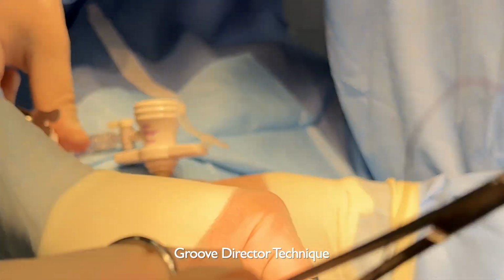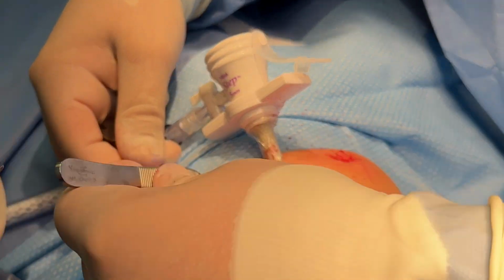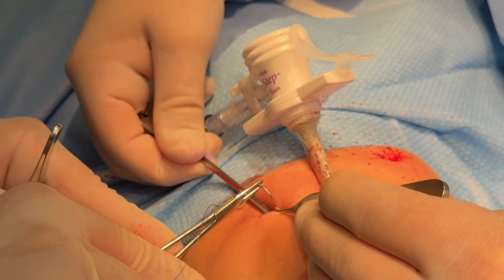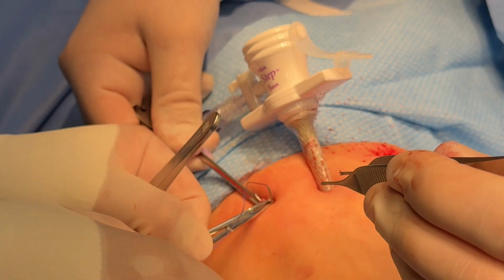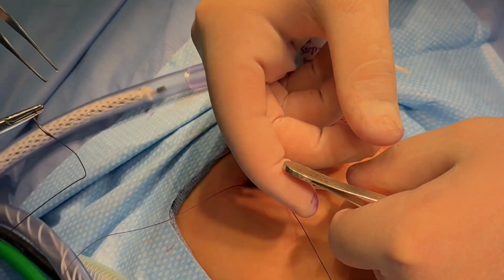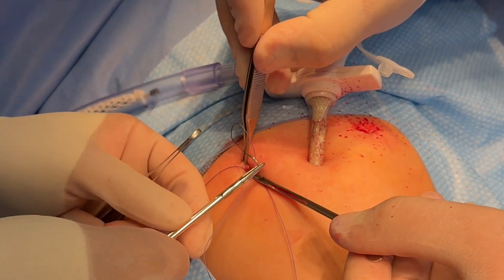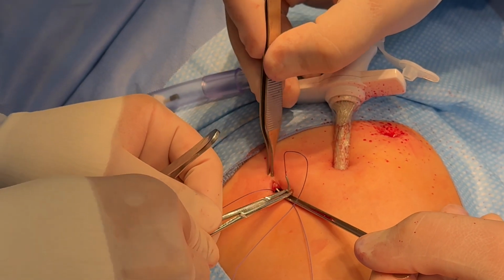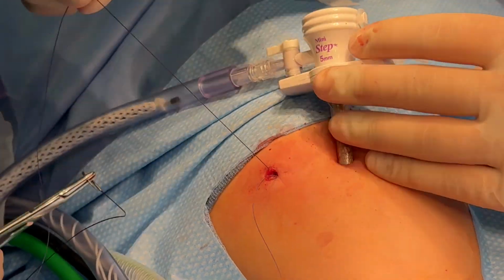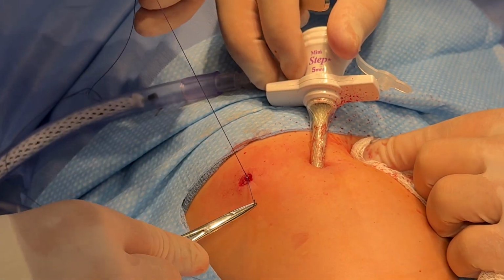The groove director is advanced through the port site below the level of the fascia and angled anteriorly. The needle is then advanced through the fascia on one side of the port site until it encounters the groove director. It is then rotated along the groove and the suture is pulled through. The groove director is rotated 180 degrees. The needle is guided by the groove and passes through the fascia on the remaining side of the port site. The sutures are then tied to close the fascia, followed by skin closure. The groove director both helps guide the needle and also protects against inadvertent injury to the abdominal viscera below.